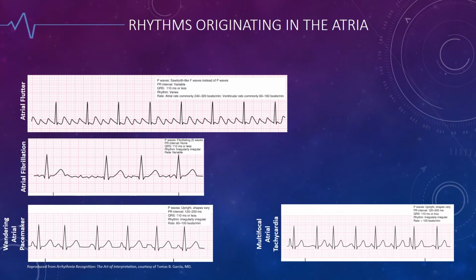Okay? Great. Moving on. Rhythms that originate in the atria. This one right here that looks like it's got shark fins all the time. What is that rhythm called? Atrial flutter. Okay? As soon as you see that, send them to me.